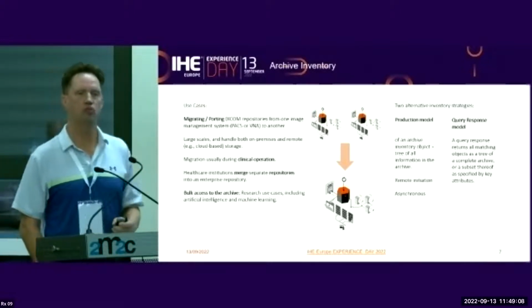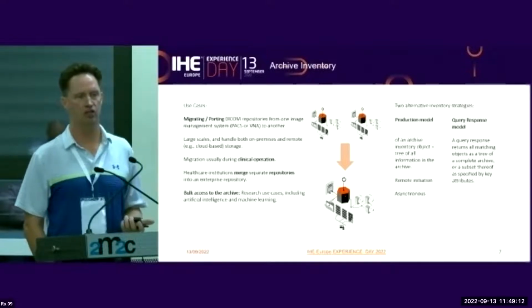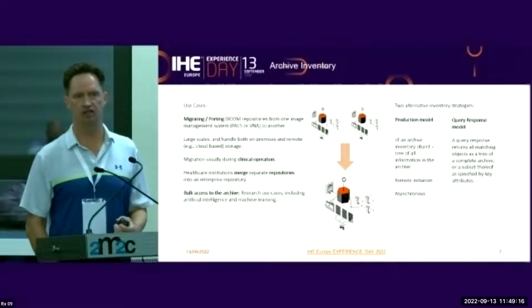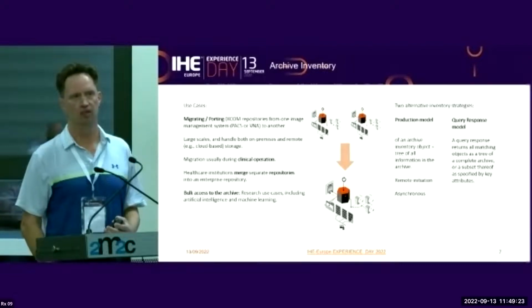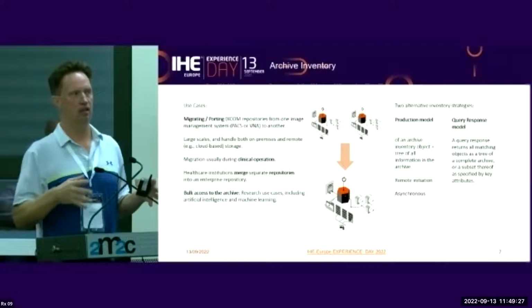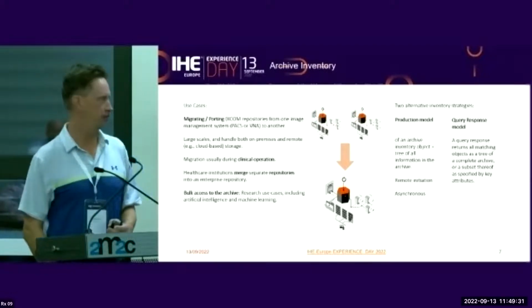There are 2 different ways to use this extension. One is that you can remotely initiate the generation of one object, like a tree of all the information within your PACS system. This would create a really big log of everything in there, and that could then be used to populate a new PACS system.